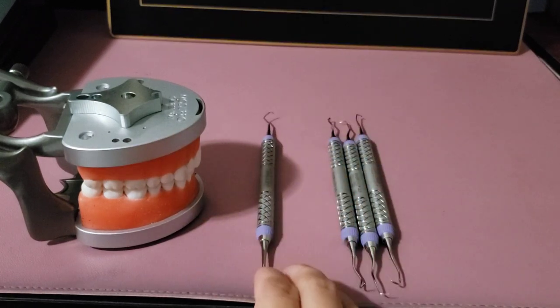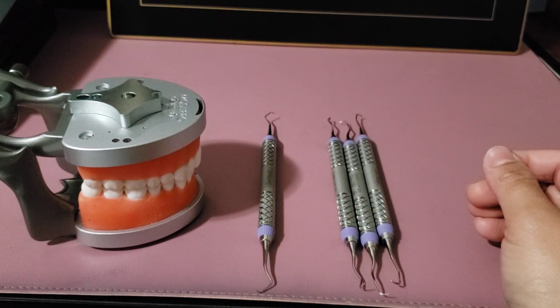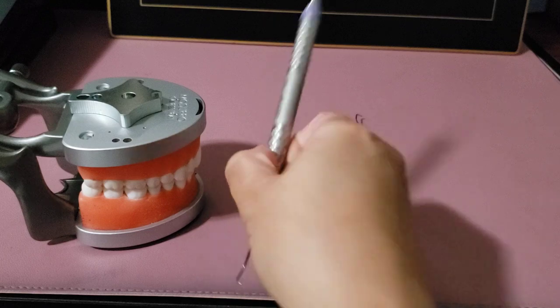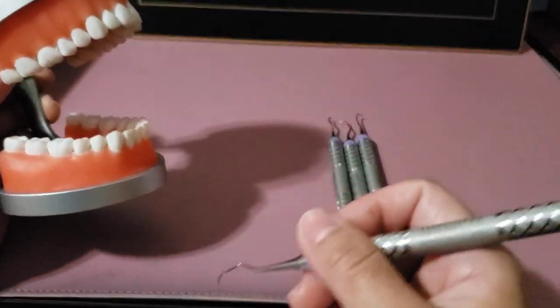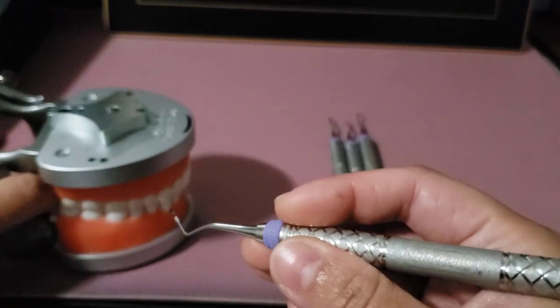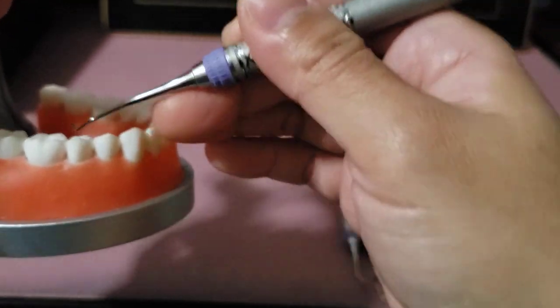Whether we're using universal or Gracey instruments, we always have three additional steps before activation: close, insert, and open away, so that just the toe-third is kept in the sulcus at all times.